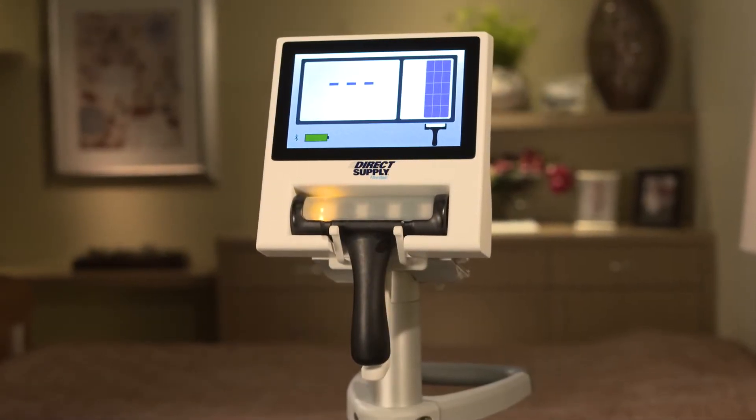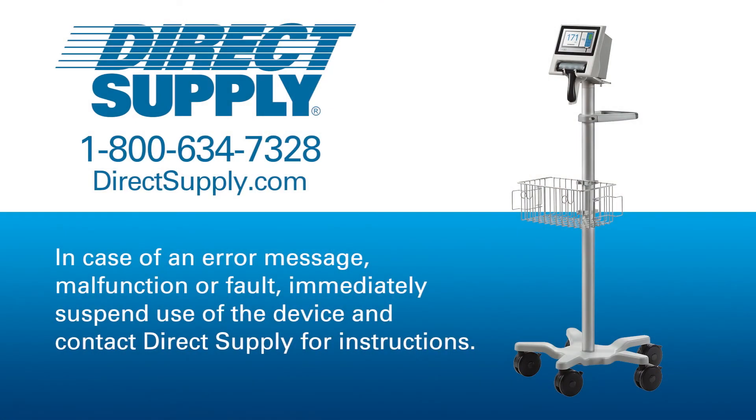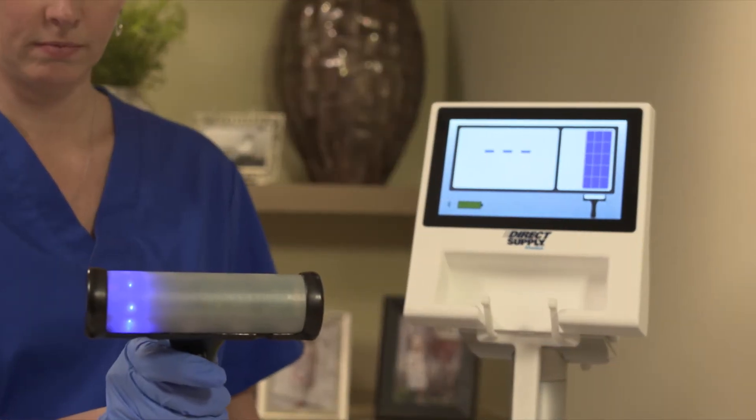The Attendant Prodigy Bladder Scanner does not contain field serviceable parts. In case of an error message, malfunction, or fault, immediately suspend use of the device and contact Direct Supply for instructions.